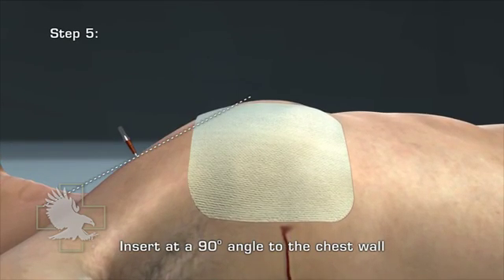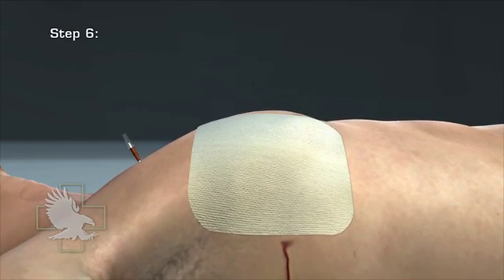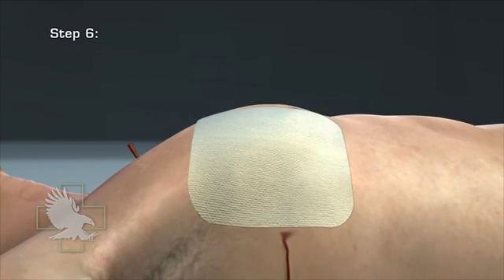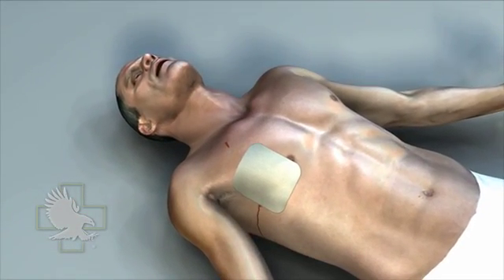An audible rush of air may be heard from the needle. Step 6: Remove the needle and leave the catheter in place. Consider securing the catheter to the chest with tape. There is no need to create a flutter valve or attach a three-way stopcock for this catheter. Remember to periodically re-evaluate the casualty.